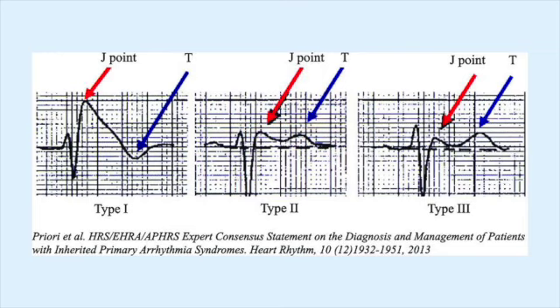So see that sudden death is the biggest risk. It's a sodium channelopathy. It's usually familial, and they get an ICD and get put on medicine usually. But you see how there's that weird J point, T wave like that. Now there is a type 2, but it's not as important. This type 1 is the most important one. Does that kind of look like an Osborn wave? Yes, correct. It's the same kind of appearance, which is also a significant finding on EKG.